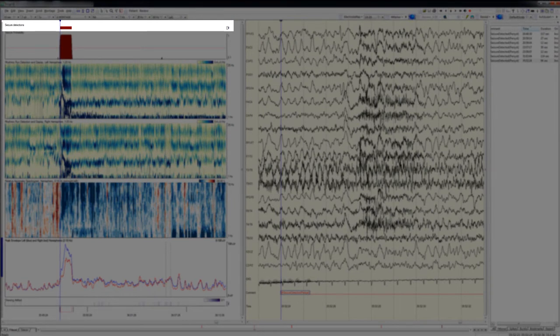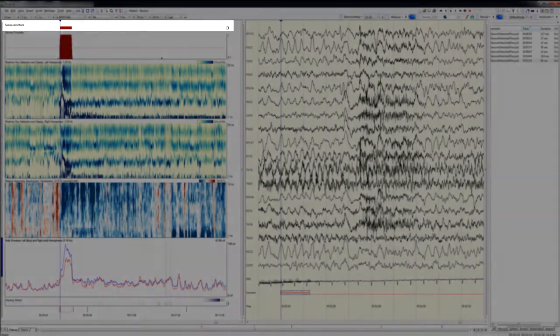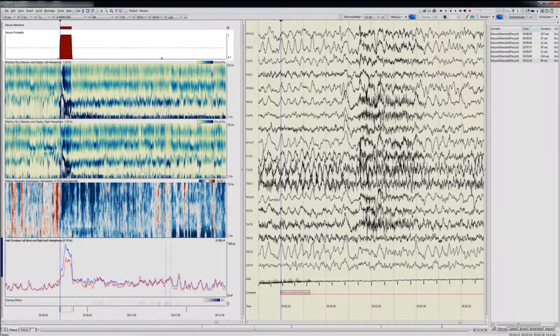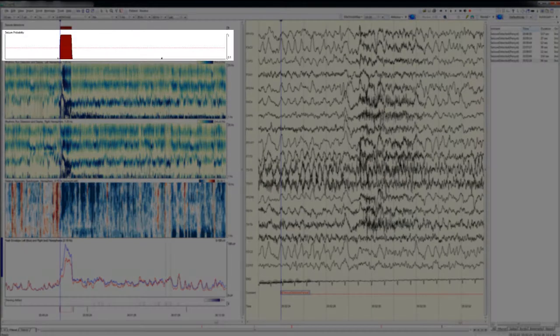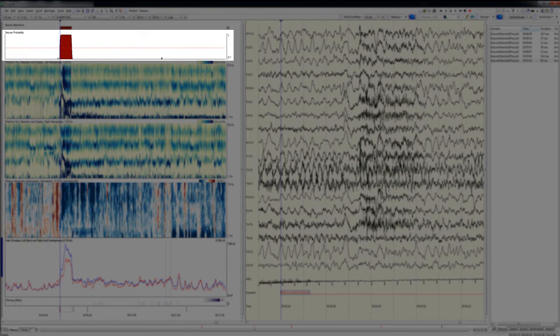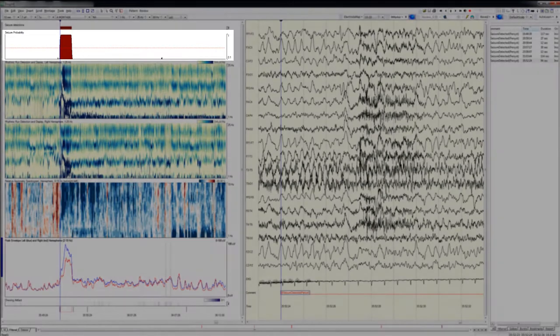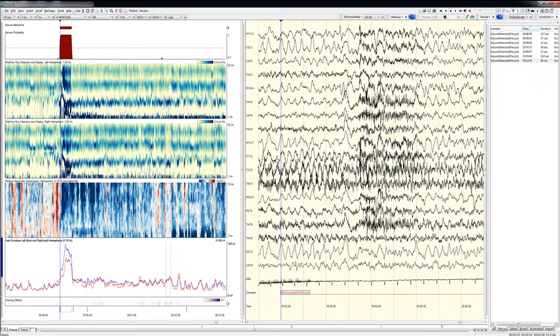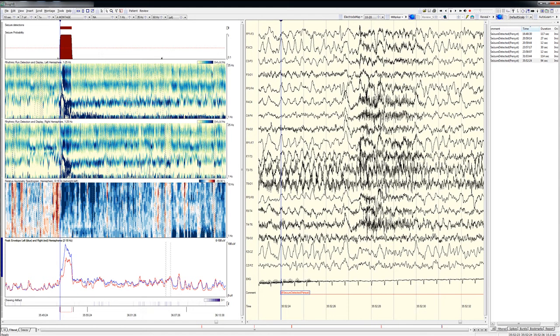Next is the seizure probability graph, which ranges from 0 to 1. This is based on output from an artificial neural network that's been trained to recognize seizure-like patterns. Seizure detections occur when a sufficient probability has been exceeded for a sufficient amount of time.